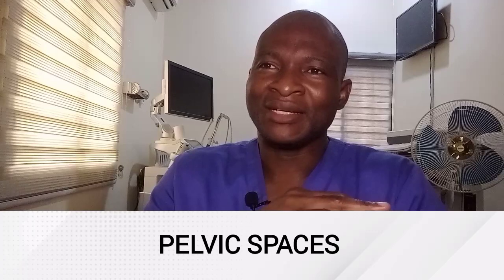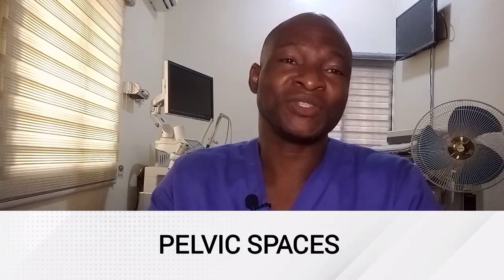Now a quick look at the pelvic spaces. We have the retropubic space. It is located anterior to the urinary bladder and posterior to the symphysis pubis. It is also known as the prevesical space or space of Retzius. The retrovesical pouch is located posterior to the urinary bladder and anterior to the rectum in males.